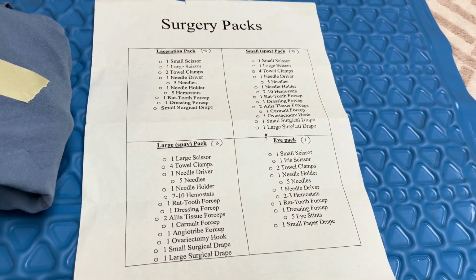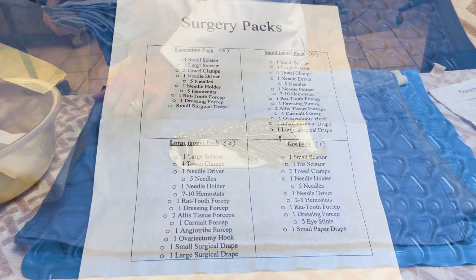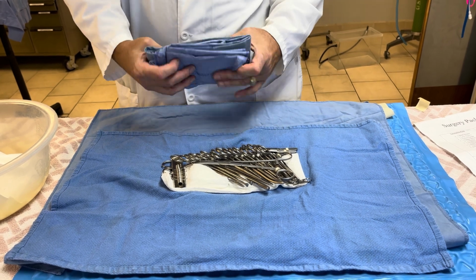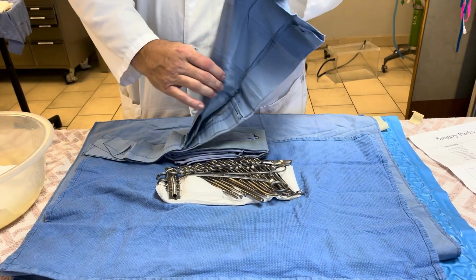Doctor will always be happy with you if you do it that way. All right? Got it? All right. Thank you. All right, so now, ready? Yep. Last thing to do is you have your drapes, okay? And it's important that the drapes be folded correctly, so let's just show this.